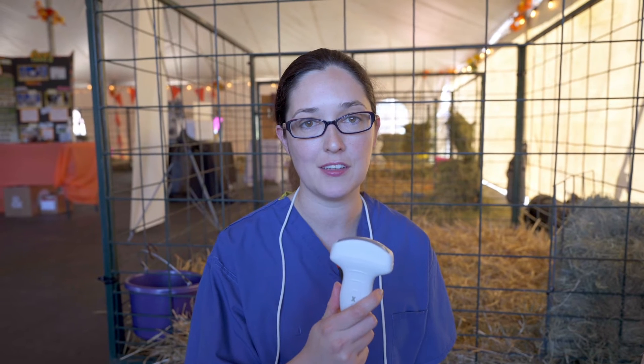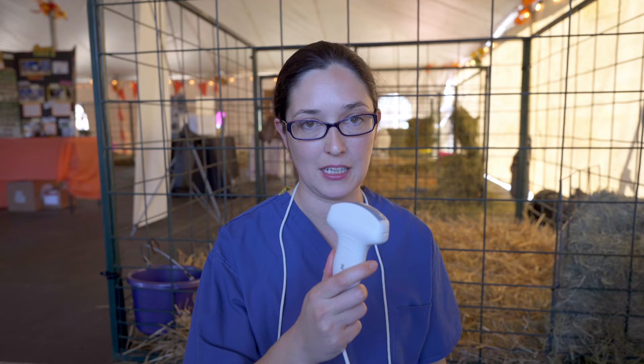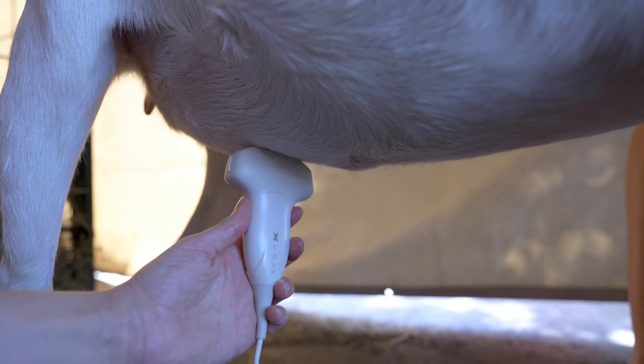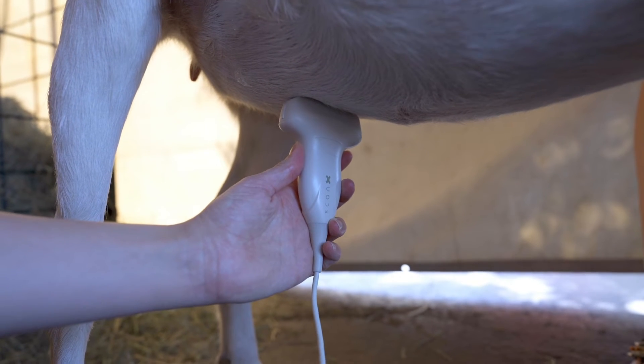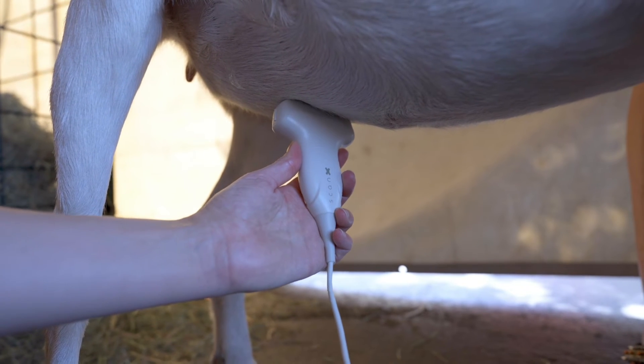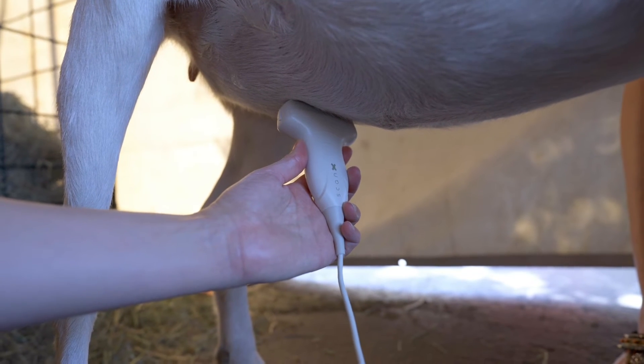From whichever position you scan, always be mindful of where you think the uterus is in the animal and angle your probe to point in that direction. When placing my transducer here, imagining she had a large udder in the way, I want to angle my probe so that I'm pointing in the direction of where her uterus would be.